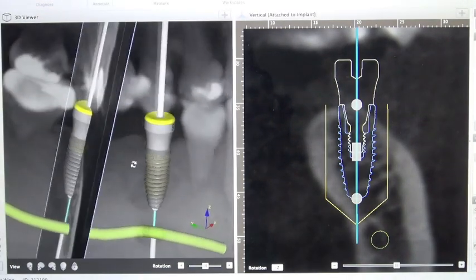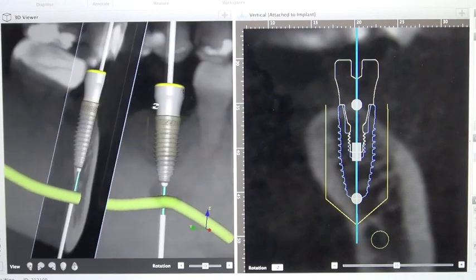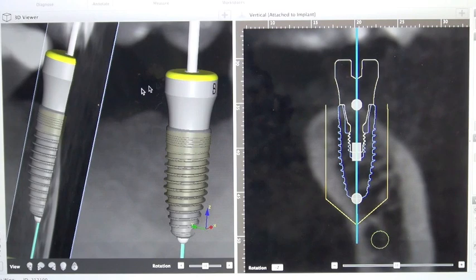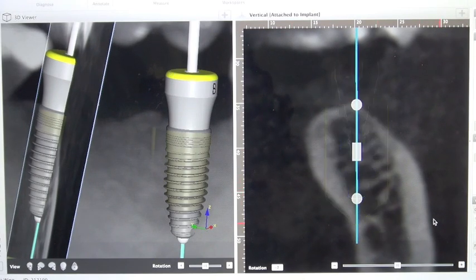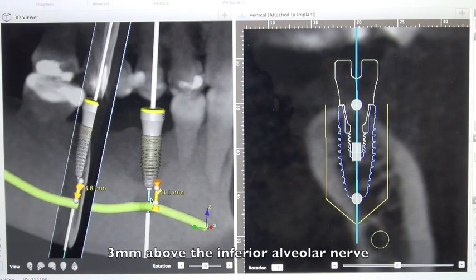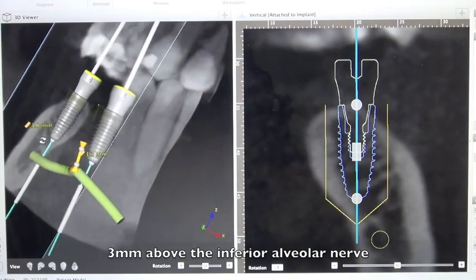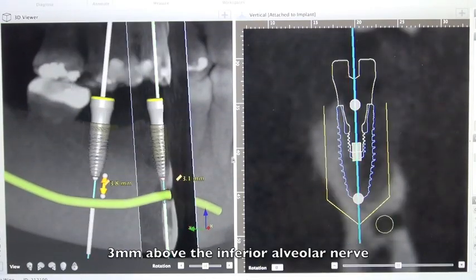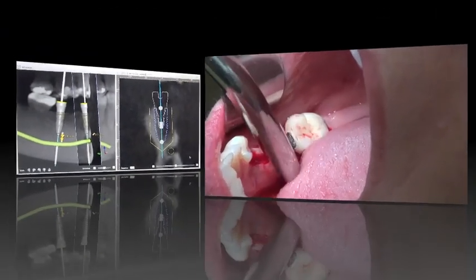We have a very tight placement. This is a five millimeter high healing abutment, so we can see we have a little bit of space above this. We want a minimum of five millimeters — ideally eight to nine millimeters for ideal space — and going deeper also enables a good emergence profile. If we look at the nerve, we can see we're three millimeters above the nerve even though it looks close. It's just in two planes of space, so the implant will look close to the nerve but it's not in the same plane.